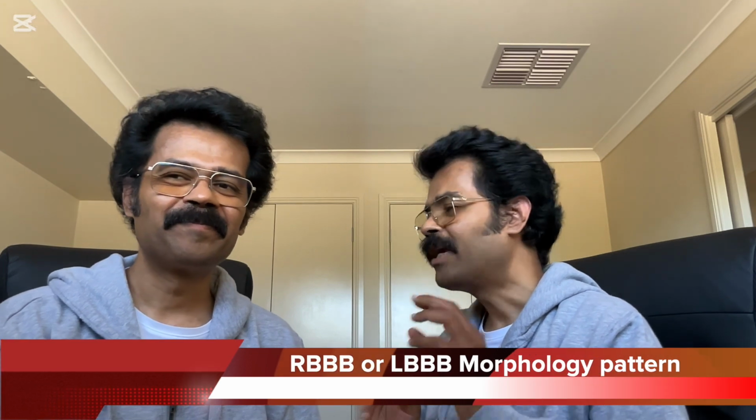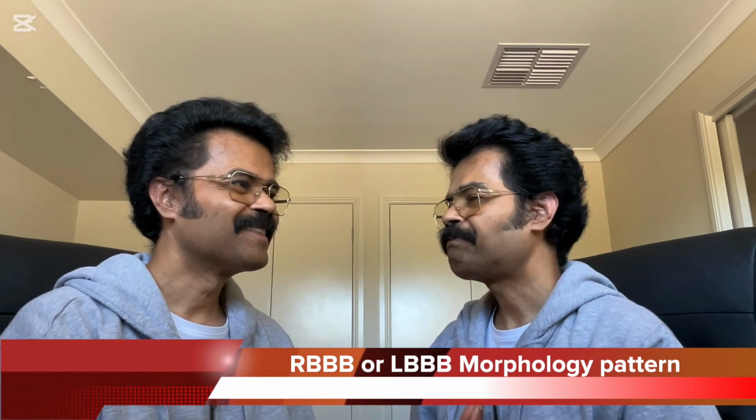So what I will suggest is, if somebody does not fulfill the step 1, step 2 or step 3 of the Brugada criteria, we look at the lead V1 and V2 and we look at V6, and we look for the right bundle branch block pattern or left bundle branch block pattern. If there is a right bundle branch block pattern or left bundle branch block pattern, then you try to find out what morphology is being fulfilled from the Brugada criteria patterns.